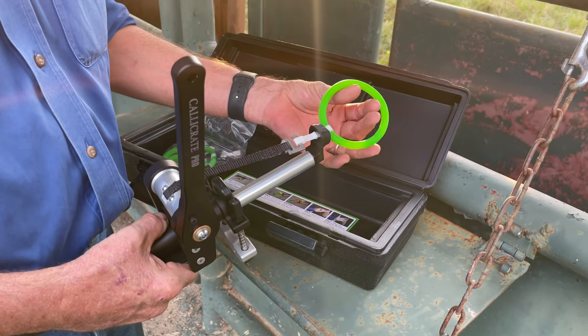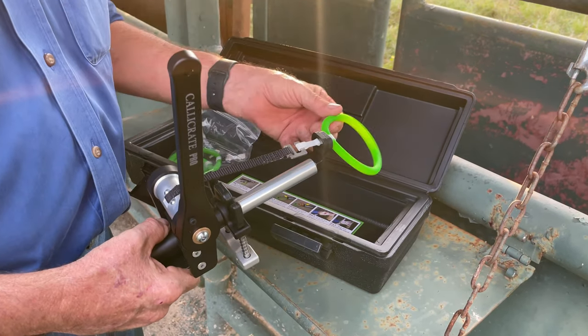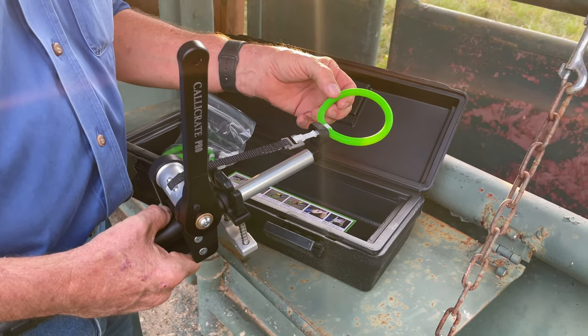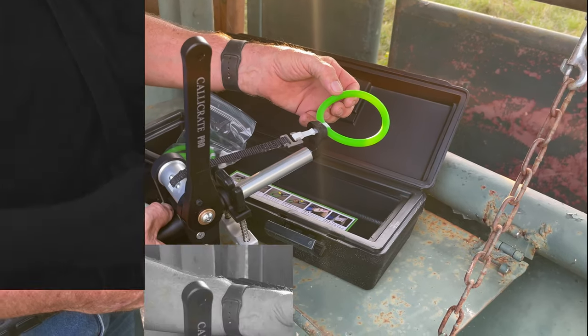You can castrate these big calves and they act like nothing ever happened. They never go off feed and they don't have any other issues. We'll show you how to do that here in just a second.